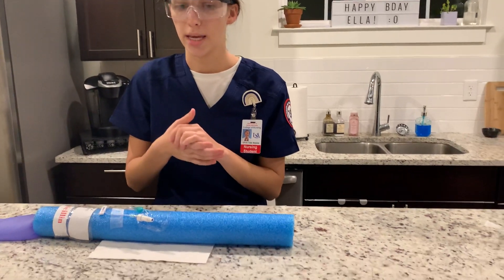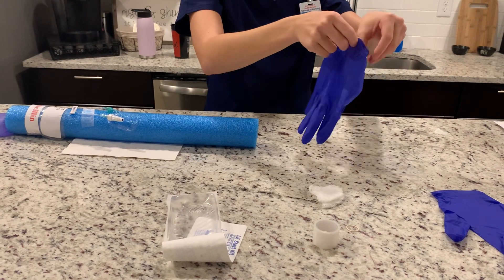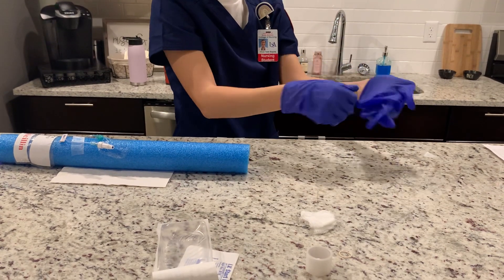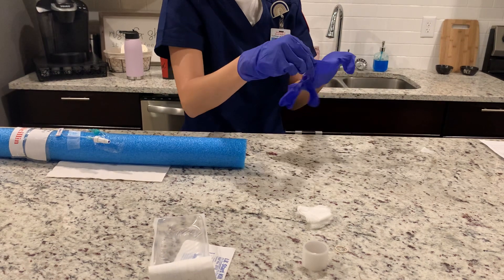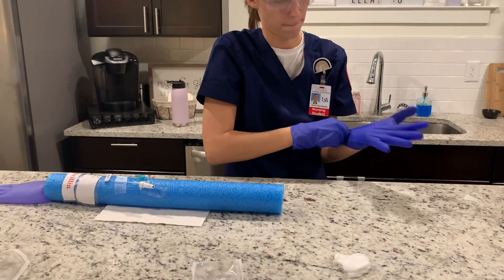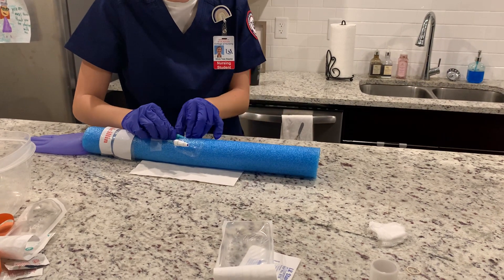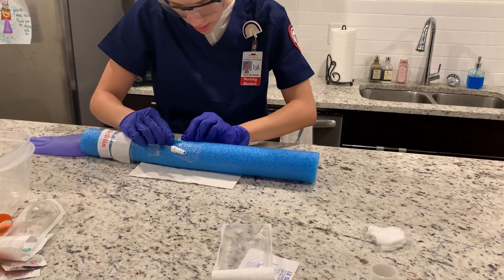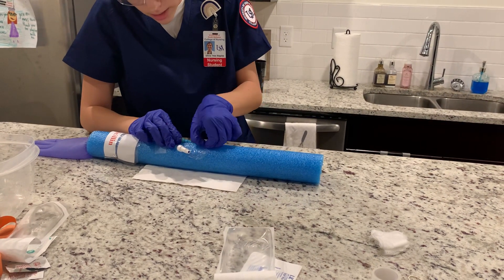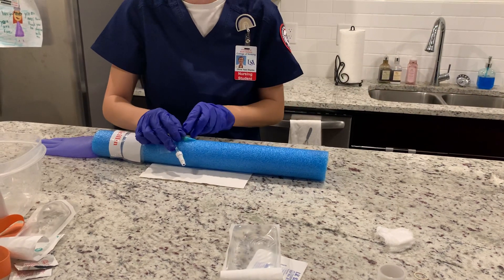Now I'm going to begin discontinuing the IV. I'm going to apply my gloves — I already have my goggles on — using aseptic technique. I'm going to stabilize the catheter and remove the Tegaderm dressing. I'm going to discard that and remove the tape.